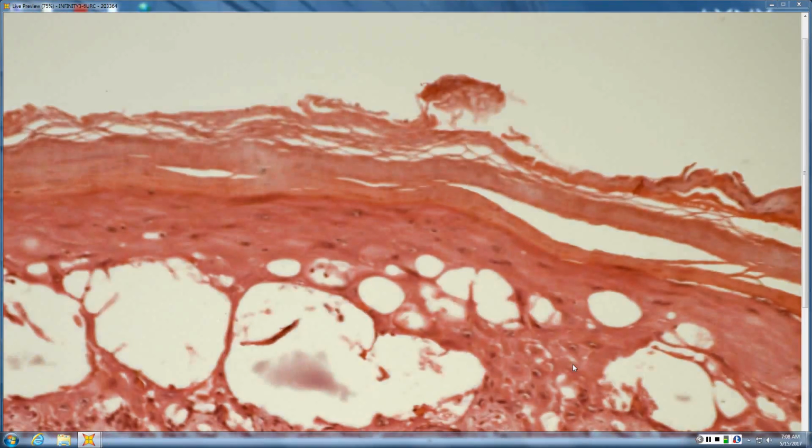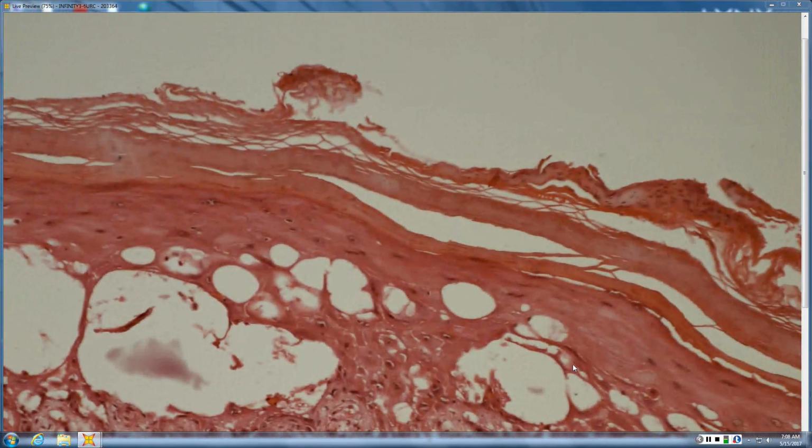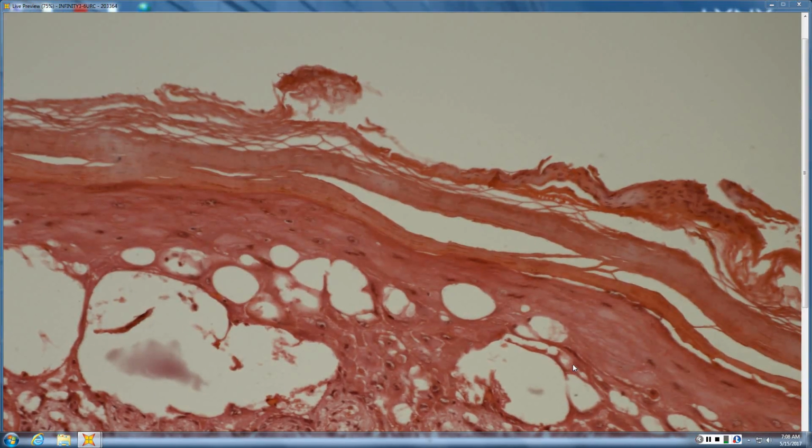You're going to see certainly some apoptotic keratinocytes, but you're seeing more confluent death really than that. But there are some apoptotic keratinocytes too. And then just sort of this mixed, subtle infiltrate here and some vacuolization. But this is acute radiation dermatitis.